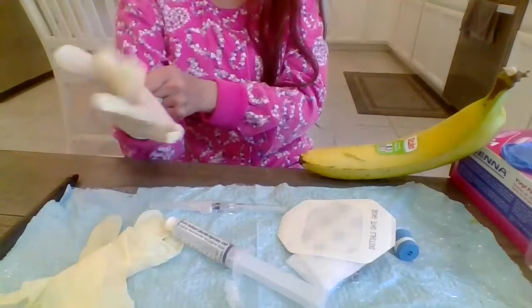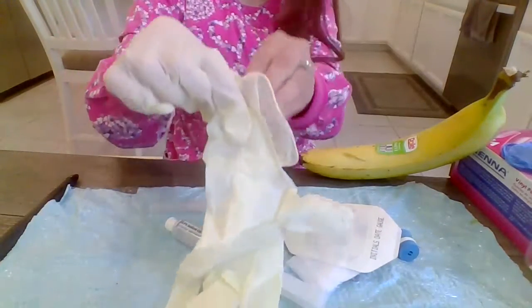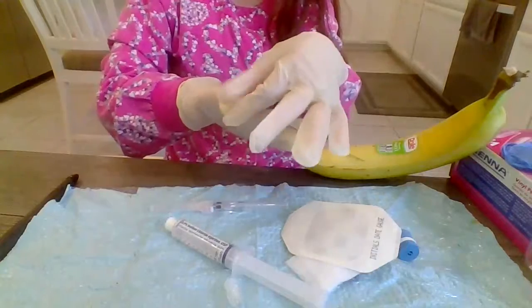Then with the sterile glove, I'm going to grab the other and put it on. Now I can straighten it up.